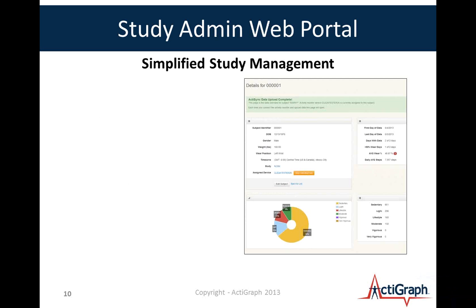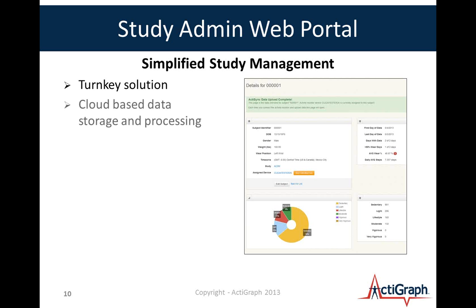And so that is a good segue into the study admin web portal that we've developed at ActiGraph. And the idea is, with this system, we want to simplify the deployment of devices and the collection of data and the management of your patient group. And so the screenshot that you see here is just an illustration of some of the information you might capture from a single patient. But just to summarize some of the key points, it is a turnkey solution.